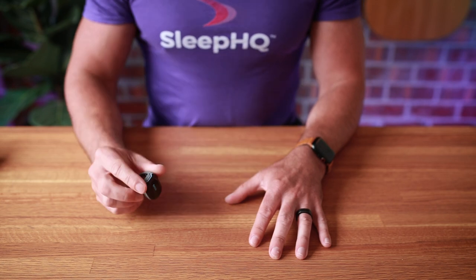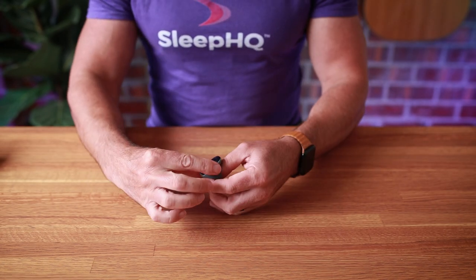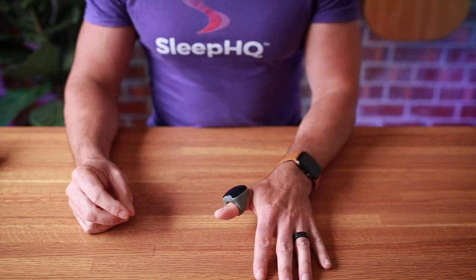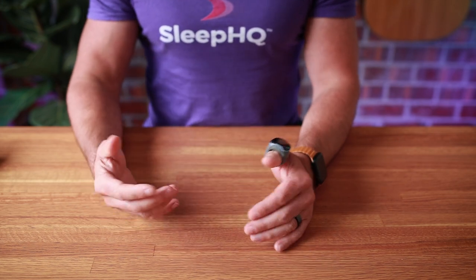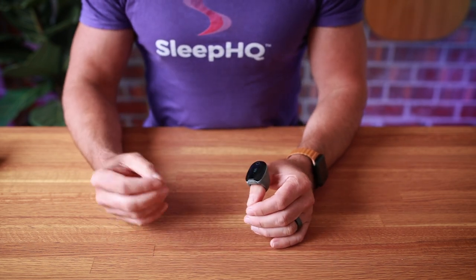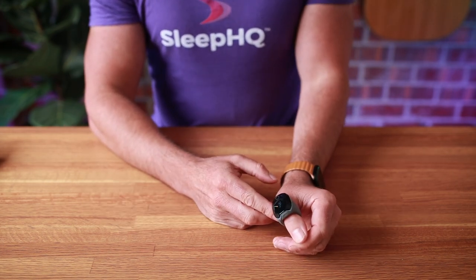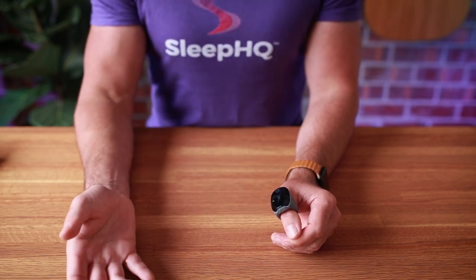Once the ring is fully charged, we can place it on our thumb or one of our fingers. I wear mine on my thumb — I find that most comfortable. Just slide it on. If you have big fingers, you might have to wear it on one of your smaller fingers. Just find a finger where it's comfortable, not too tight, not too loose. The ring will automatically turn on when you place it on your finger, and when you take it off it will automatically turn off and sync to your app.